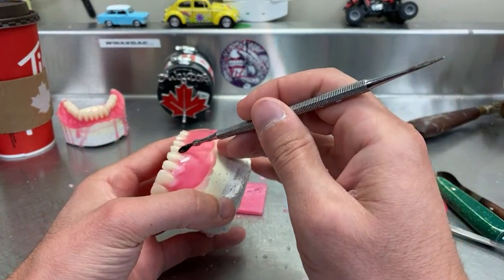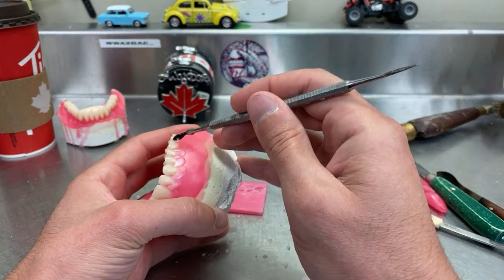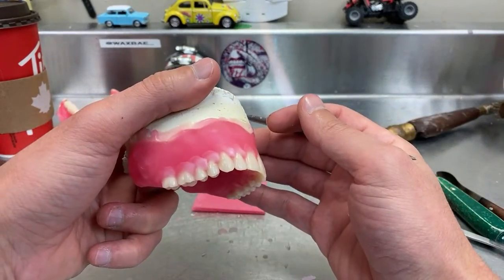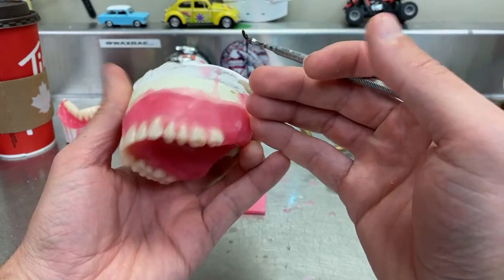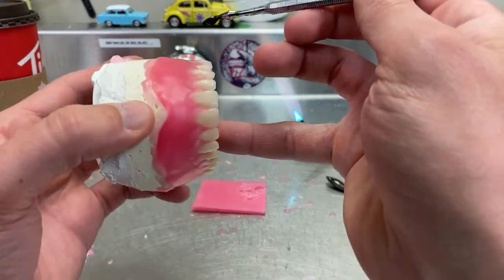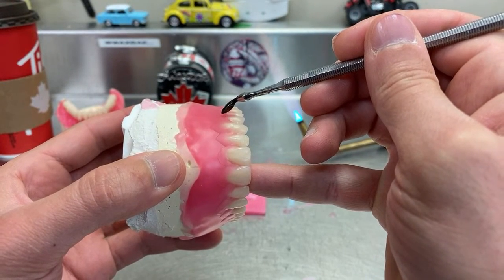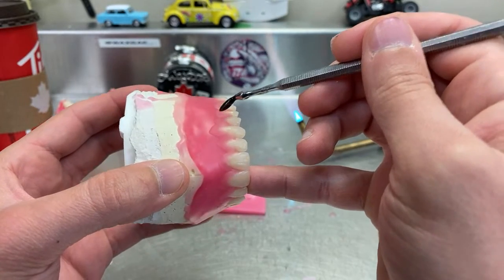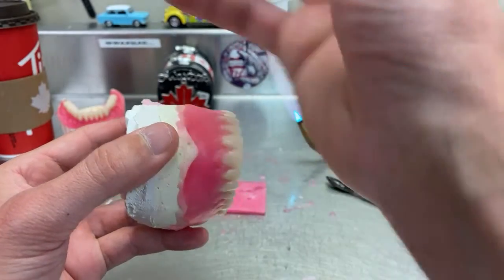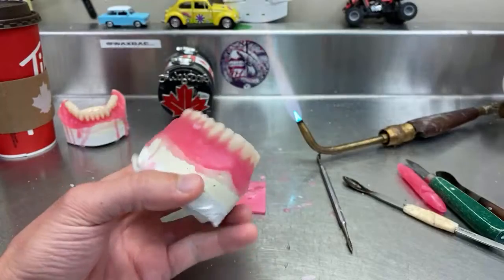I'm just adding to all of them now so I can actually carve it. Because if you add only in one place, it will not look good. So now you can see where I added everything. Add a little bit here. I don't know if you can see it, but I'm not even trying to touch the wax. I just touch it and then I lift and move, so it's not actually sitting on the wax. Just the initial touch to get the wax going, and then it's away from it and you pull, and the wax will be like elastic. Okay, everything is good here to this point. Any questions at that stage?